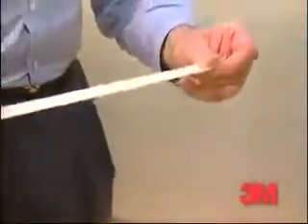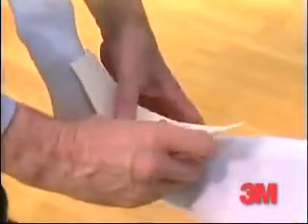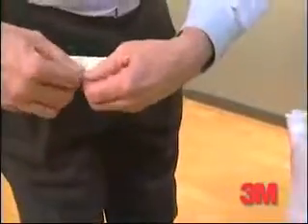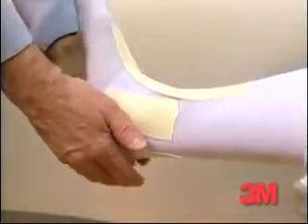The other area that we need to protect is the dorsum. So one piece there, and then the last area of protection will be over the Achilles. So now we have the ankle prepared.